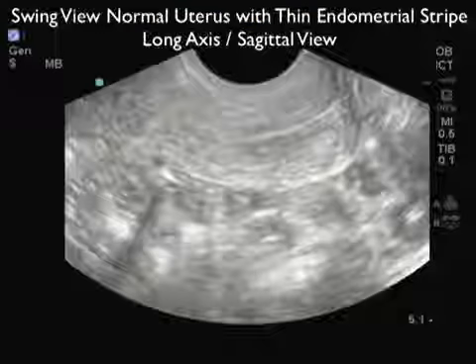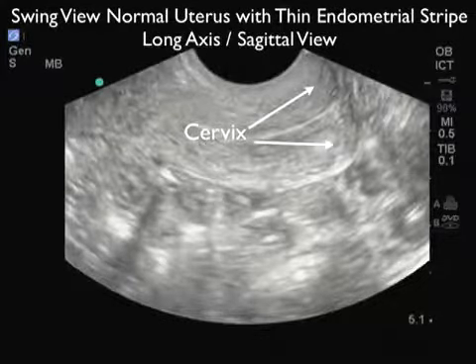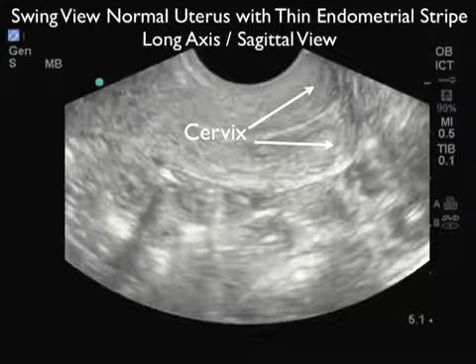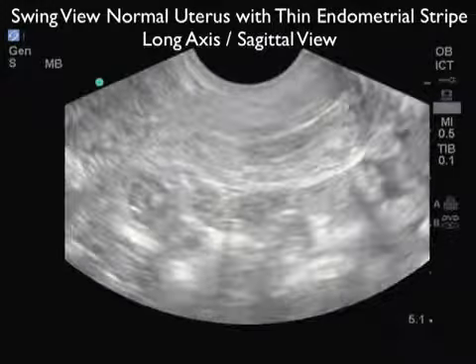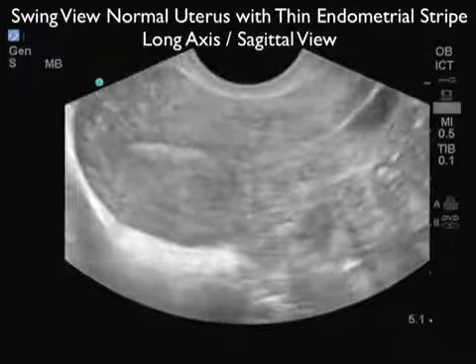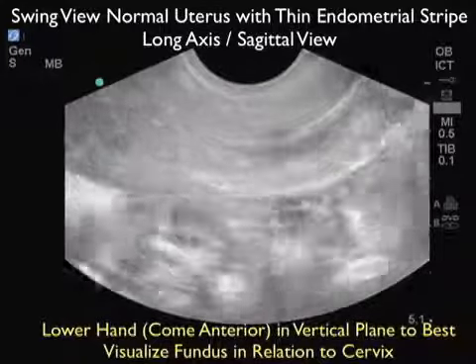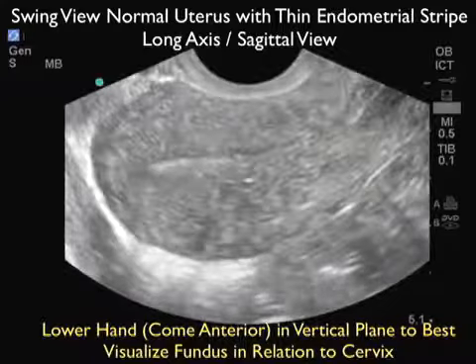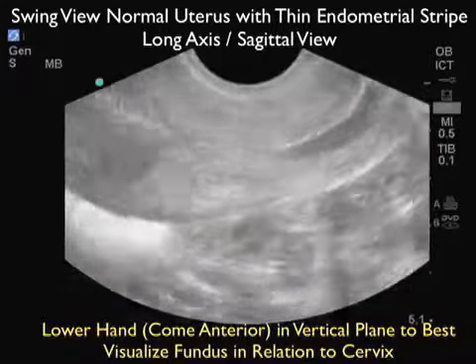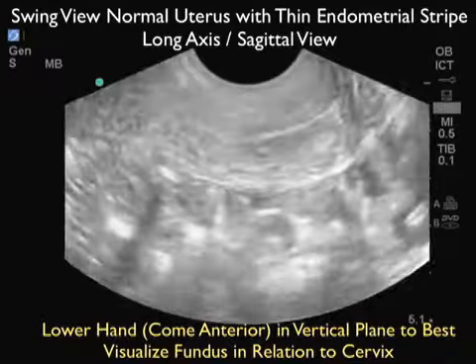Here's a resulting ultrasound image as taken from a transvaginal approach long axis or sagittal view through the female uterus. And we see the two portions of the cervix well seen on bedside sonography in the middle of the image here. Now notice as I swing the probe more anteriorly, I'm going to bring the fundal region of the uterus into view. So if I angle the probe more posteriorly, there I have cervix, and more anteriorly, or dropping my hand, as I'm doing now, I'll best bring the fundal region of the uterus into the ultrasound image.